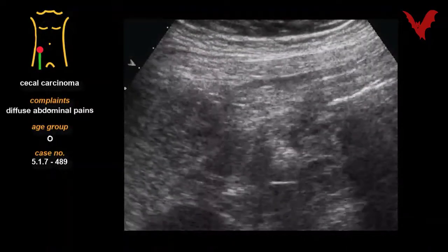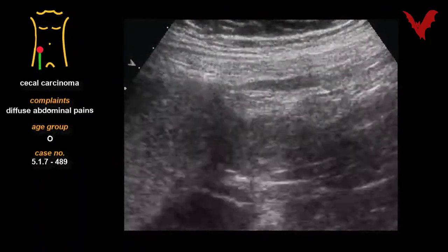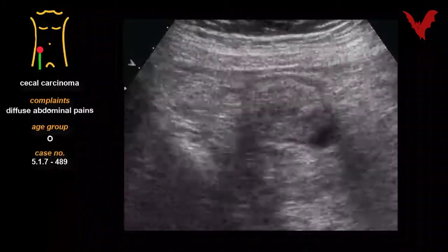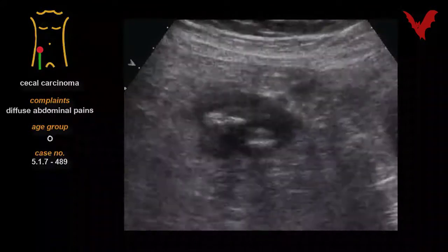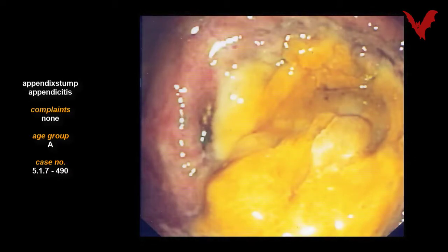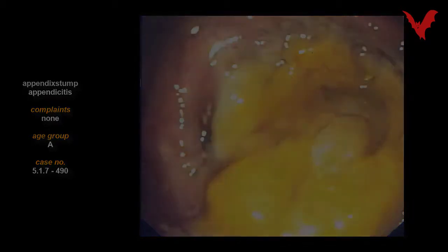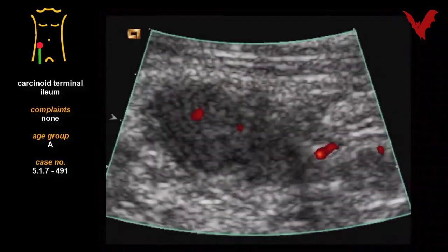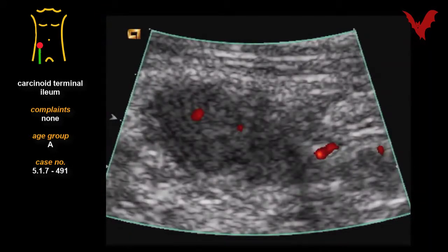In case 488 you see a typical carcinoma of the appendix. Case 489 shows a typical cecal carcinoma. In case 490, the appendix was said to have been completely removed, which was not the case.